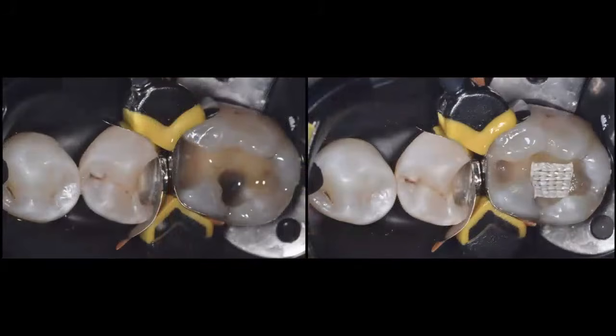So I acid etch, doing selective enamel etching here, and then I use my two-bottle system. For this case, I used OptiBond eXTRa Universal from Kerr, which is my go-to adhesive system in my office. I apply the primer on the dentin, and then I remove the excess primer and solvent with a little bit of air after maybe 15 or 20 seconds of dwell time. Then I apply two to three coats of my adhesive.